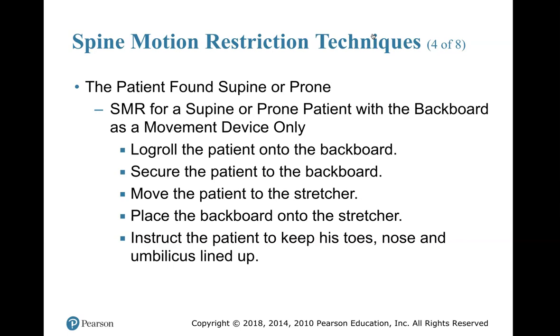The only way I would not use a scoop stretcher in this situation would be if my company did not carry one. Because with a scoop stretcher, I don't have to log roll the patient at all. I just lift them up on one side, place half of the stretcher, lift up the other side, place the other half, connect it, and then we have a full stretcher. We lift them up, put them on the stretcher itself, and then unhook it and pull the sides out, and there's no log rolling and gross motor movement.